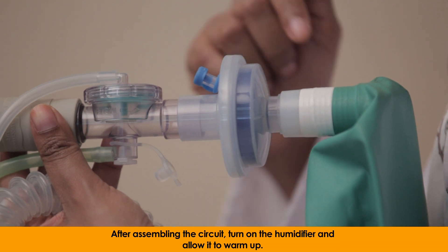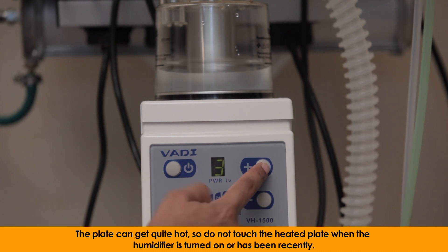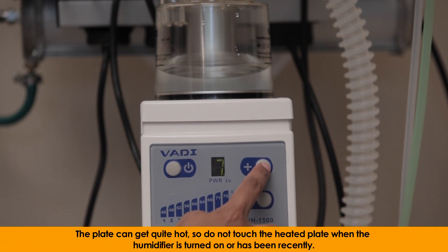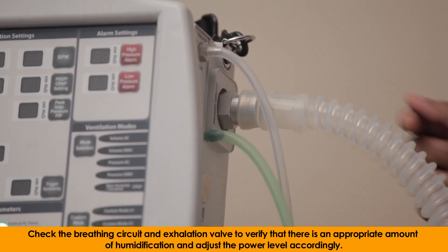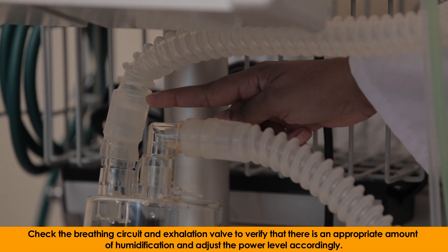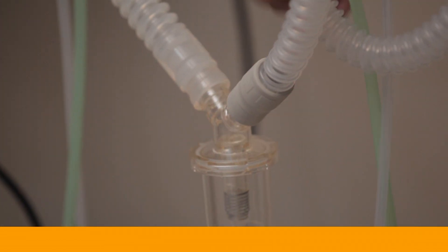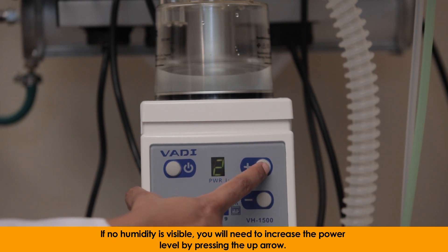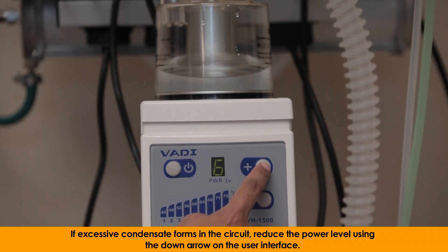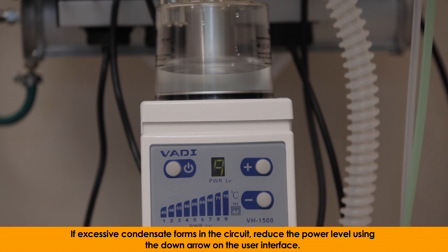After assembling the circuit, turn on the humidifier and allow it to warm up. The plate can get quite hot, so do not touch the heated plate when the humidifier is turned on or has been recently. Check the breathing circuit and exhalation valve to verify that there is an appropriate amount of humidification and adjust the power level accordingly. If no humidity is visible, increase the power level by pressing the up arrow. If excessive condensate forms in the circuit, reduce the power level using the down arrow on the user interface.